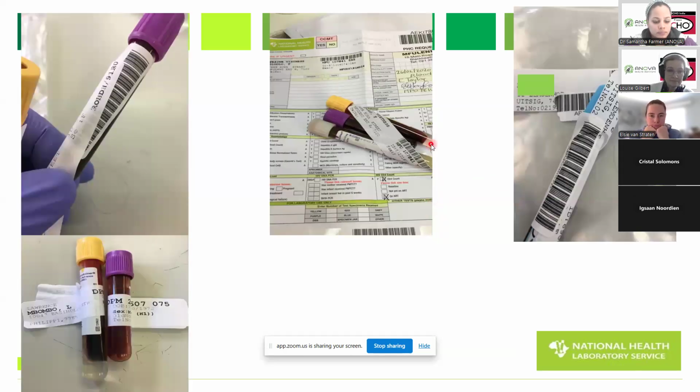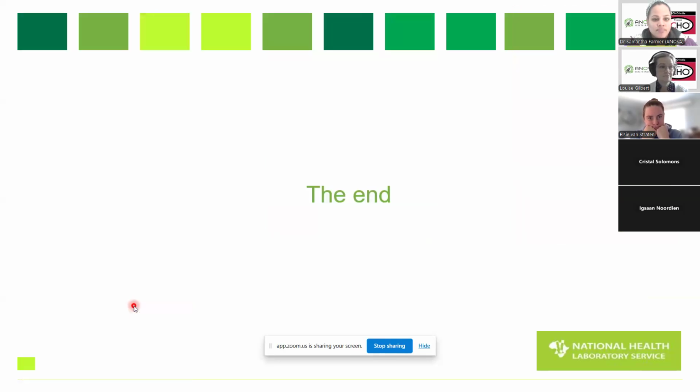And then this is also what we don't want. If you didn't have enough stickers, just write on the tube, but don't stick 3 tubes together. Don't stick the label over the cap. We can't take it off. Don't cover the barcode with a sticker. We can't read it with our barcode scanners. These little wings on the side don't fit neatly and comfortably in the racks that we put on the machines. So this is what we don't want.